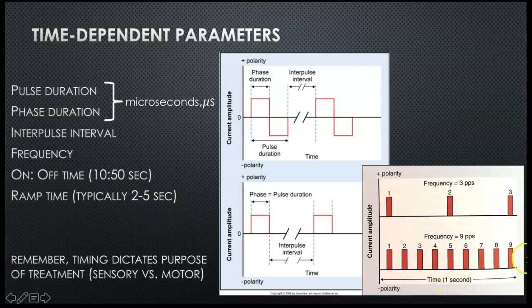So it's like, dit, dit, dit, dit, dit, dit, dit, dit. You like my sound effects, I'm sure. So we'll play with frequency. You'll get to feel the difference when you adjust the frequency and how it feels to the person that it's on. On time and off time, you just get to choose this.